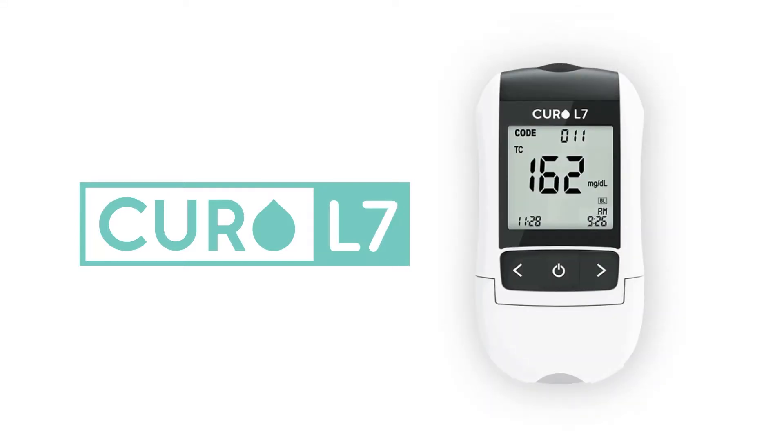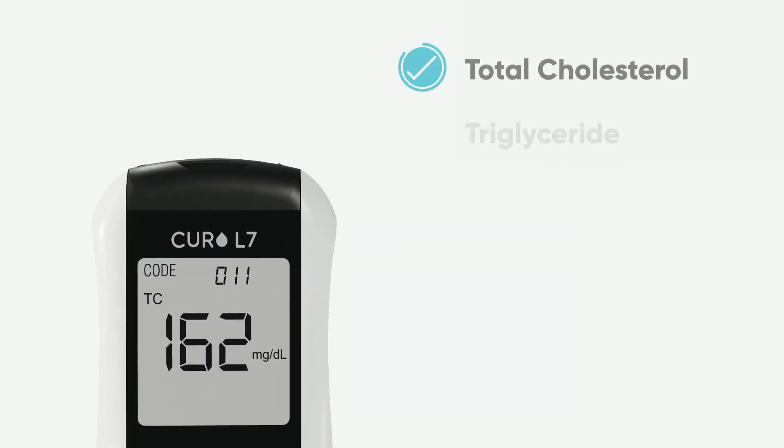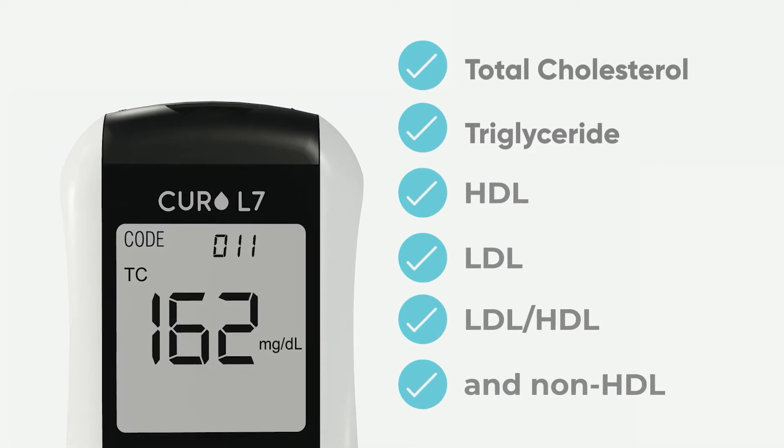In this video, we are going to show you how to measure your lipid cholesterol level using the Curo L7 device. Curo L7 is a professional-grade testing kit for lipid blood profile. It provides six test results including total cholesterol, HDL, triglyceride, and calculated LDL results with one lipid profile test strip.